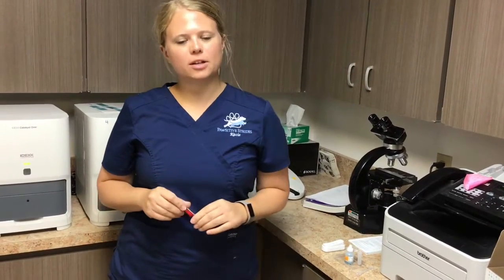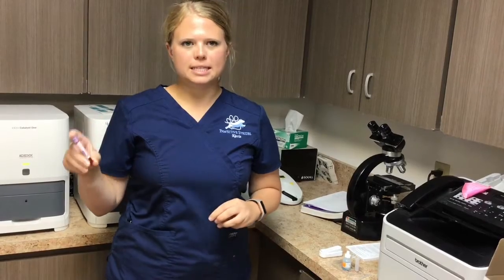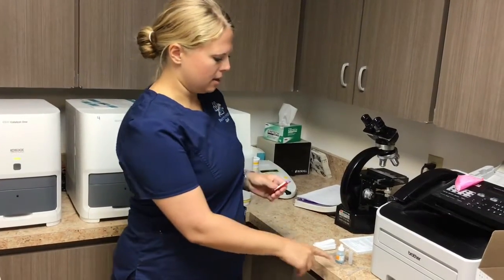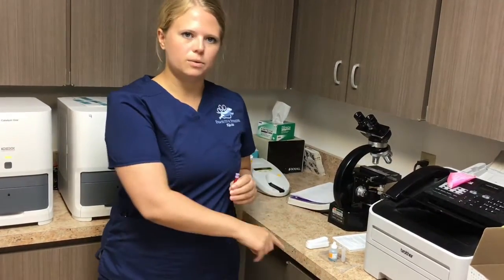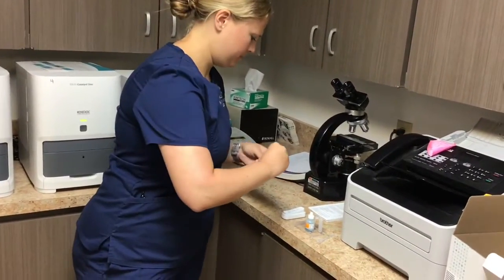I'm going to demonstrate how to perform the 4DX serologic test, testing for heartworm, Lyme, the anaplasma. I've got my whole blood sample treated with anticoagulant EDTA. I'm going to enter this into my pipette along with the reagent in order for me to place it on the snap test.